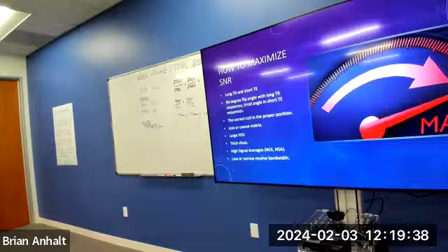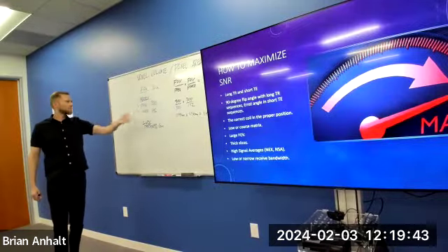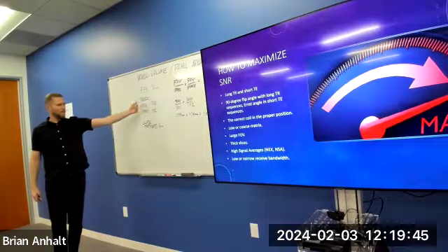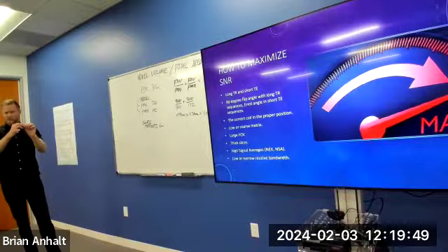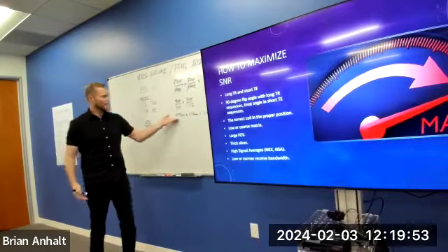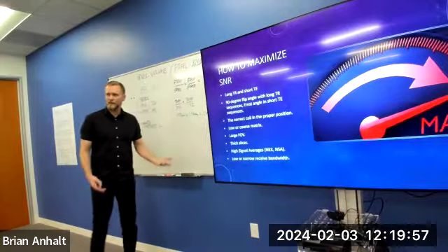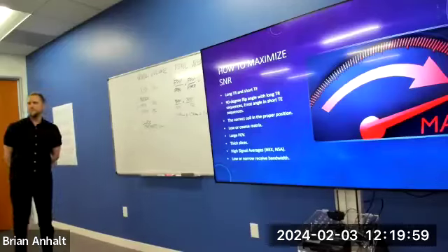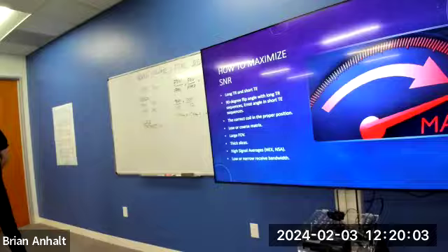1.45 square millimeters. So in this case scenario, if I selected a 30 centimeter field of view, my frequency matrix was 320, my phase was 192. If I zoomed in on each one of those little pixels, this is the dimensions I get. 0.93 in one direction, 1.56 in another. You multiply those together, that gives you your area. Not too tough, right? Hopefully.